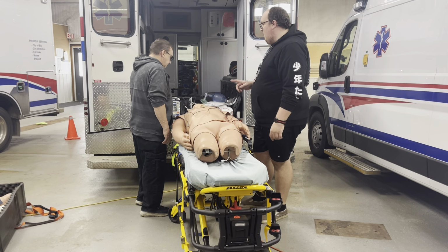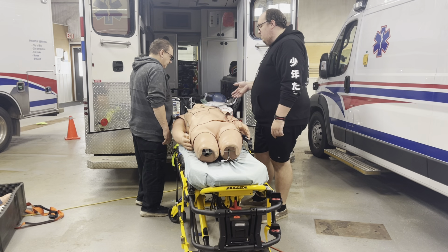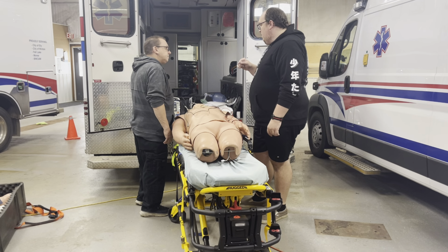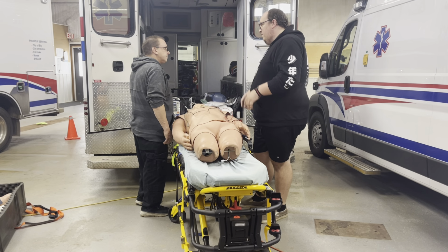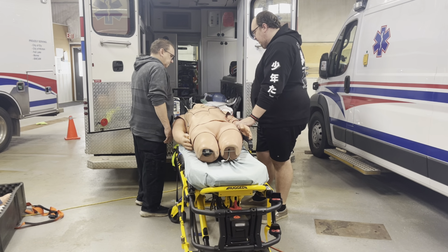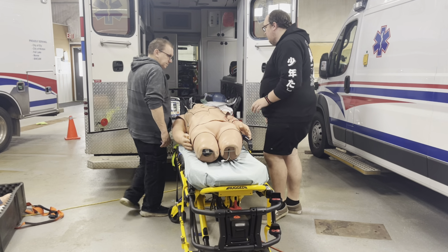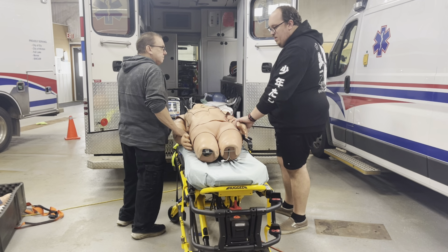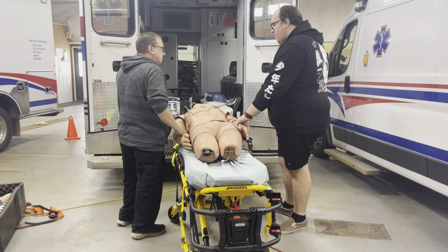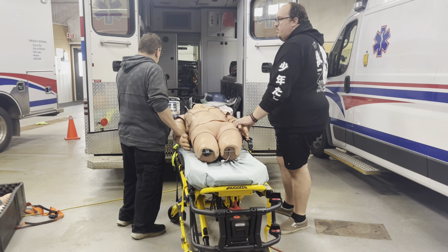He's alert and he's talking, but he's super slow in how he's talking to you, and he just doesn't feel like he can get up, maneuver around. Check his SpO2, maybe use some oxygen. So when you put SpO2 on him, you get an oxygen saturation of around 90%. And you put your oxygen on what flow rate you want?